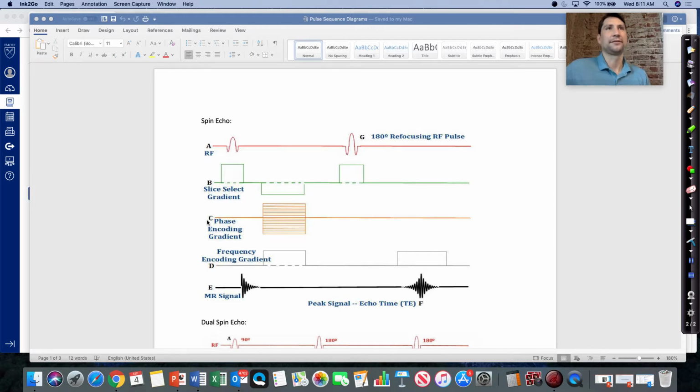The shorter axis, because we want to reduce our scan time equation, and phase encodings are part of the scan time equation. And usually the shorter axis, we align it with the smaller part of the anatomy so it doesn't wrap into our image. Have you guys experienced any phase wrap while you've been in clinic? A lot of times with MSK imaging, it gets a little tricky, especially with the coils maybe laying right up against the body, things like that.